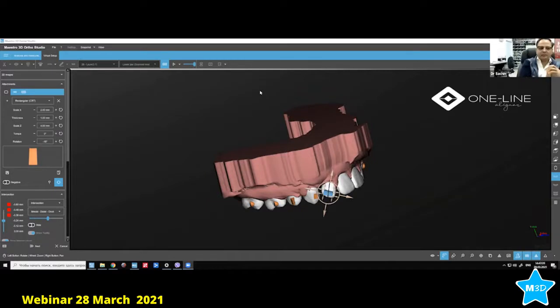It will not happen. I always think it's not only a distal or mesial movement. It's always a tipping. Yes, so that's why. So the question should be, if we move the entire tooth distally, the crown will move first. So we need to compensate also the root. But the attachment you placed earlier, the yin yang one, can also move the tooth distally. Yes, you can move it distally. You can also move with this one, but the question remains the same. You have to plan the movement.